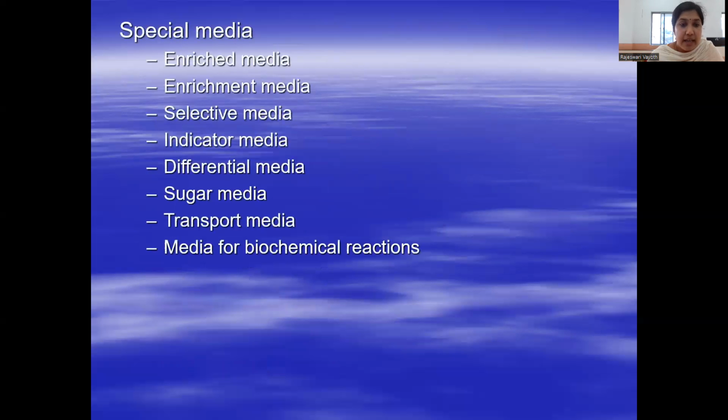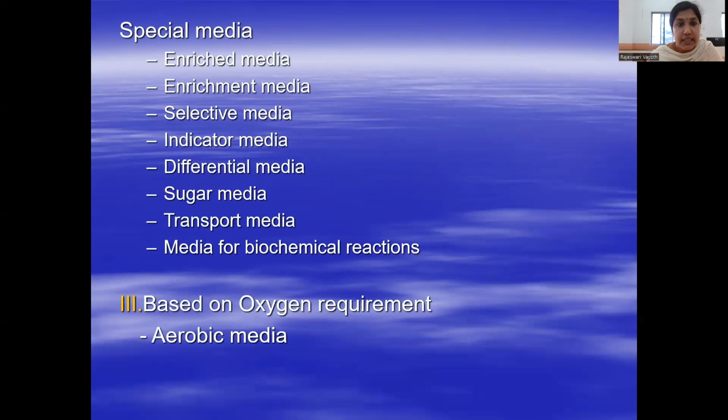These special media are again of different types. These are enriched media, enrichment media, selective media, indicator media, differential media, sugar media, transport media, and media used for biochemical reactions. Based on the oxygen requirement of bacteria, media are classified into two types: aerobic media and anaerobic media.